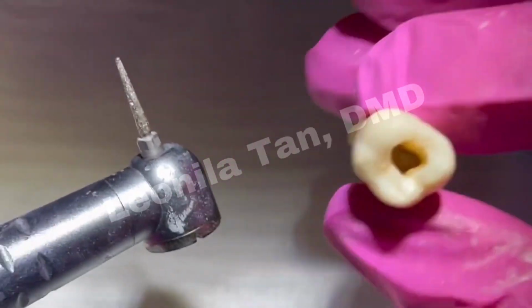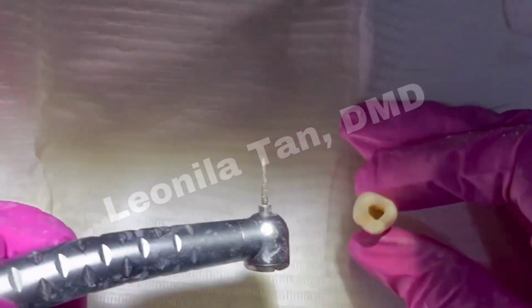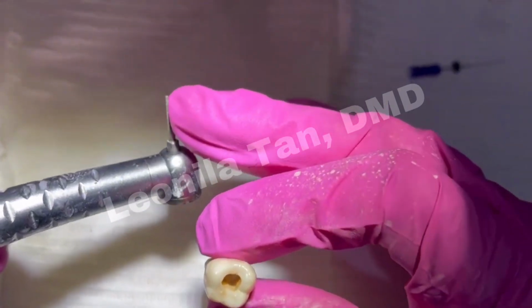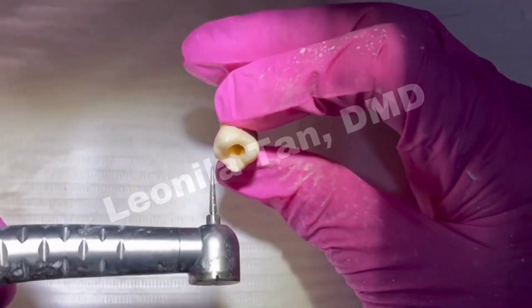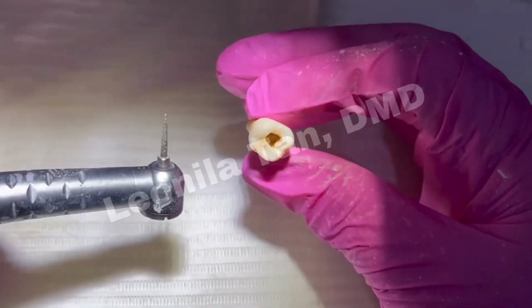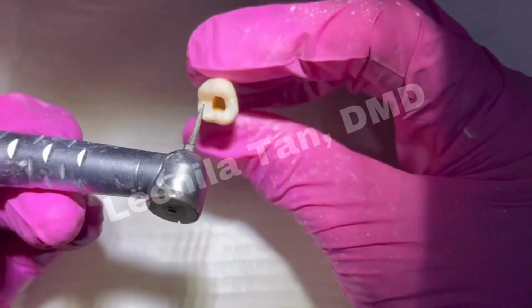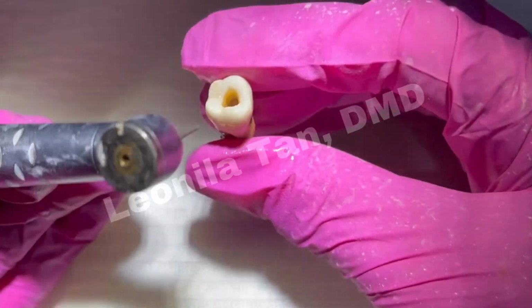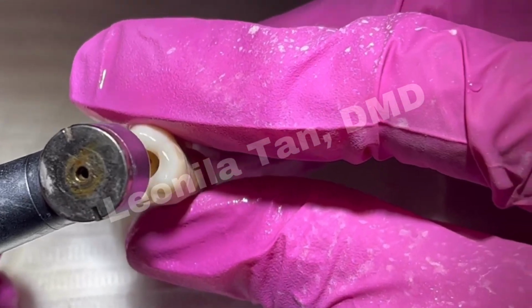Now, a while ago, I was using the safe end endo burr. I shifted to your regular prosto burr. It's dangerous when you're using a regular prosto burr because you can easily hit the floor of your chamber. But if you use your regular prosto burr, you just have to make sure that you are hitting only along your walls.